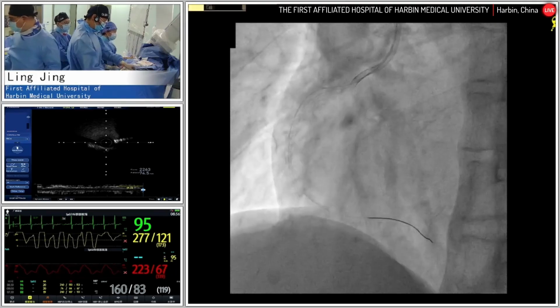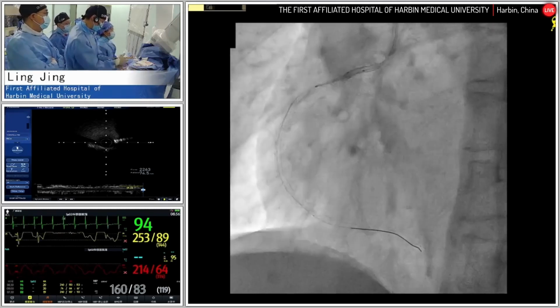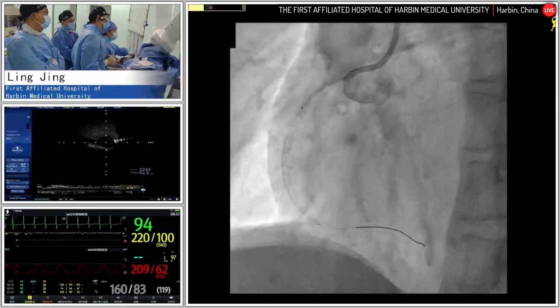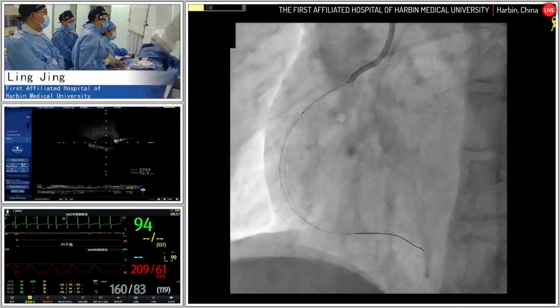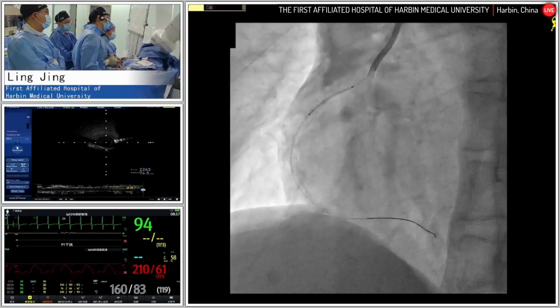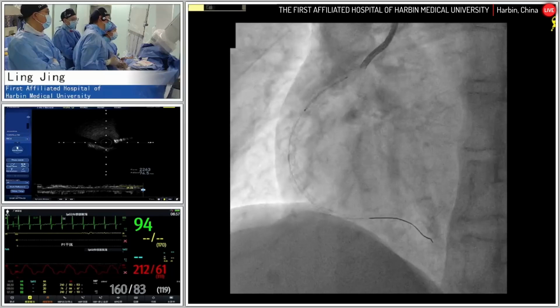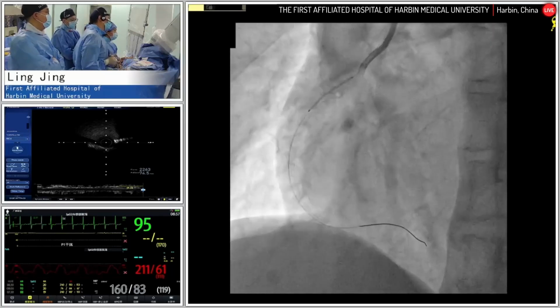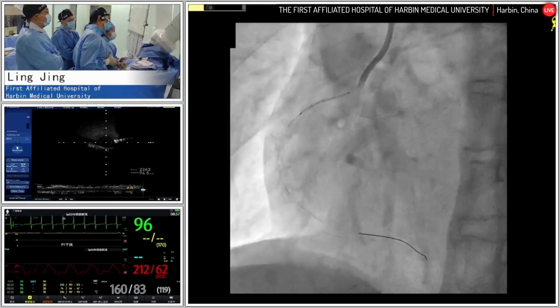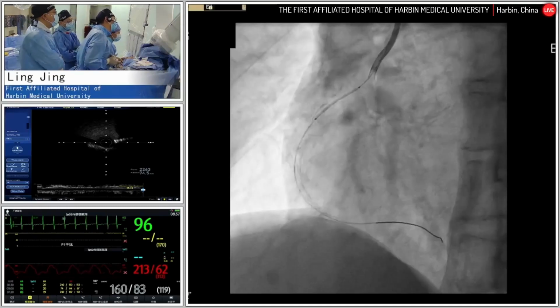And last time, I think Professor Li made a demonstration of these devices. For the Caravel microcatheter, I think some of the audience is very interested in it. The Caravel microcatheter has a low profile and a large lumen. So the outer profile is small, and also the tip is relatively tapered. The tip length is 5.0 millimeters, and the entry profile is only 0.5 millimeter, 1.4 French.